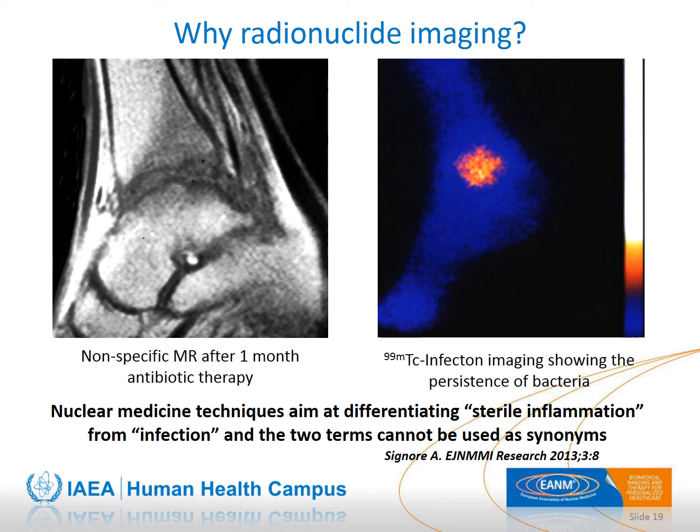However, this technetium labeled infection agent imaging shows focal uptake in that area to conclusively prove that infection was present and that antibiotic treatment needed to be continued.